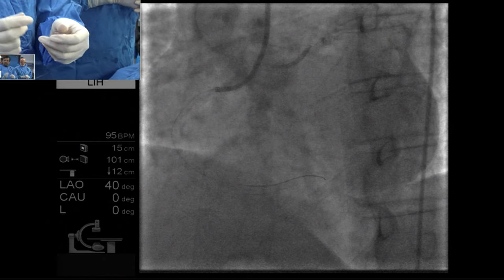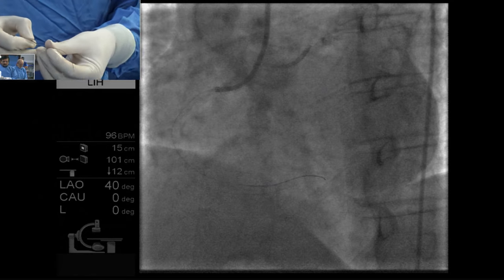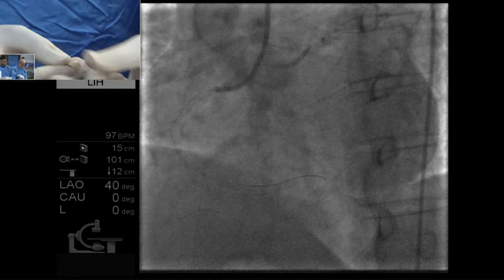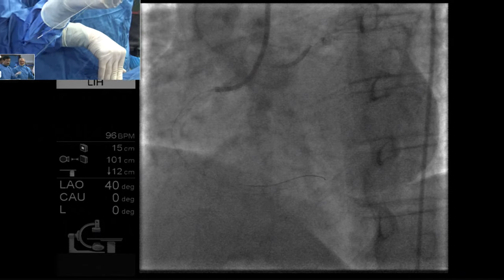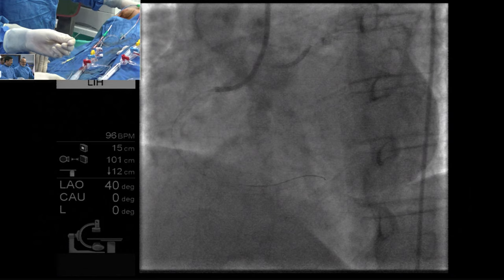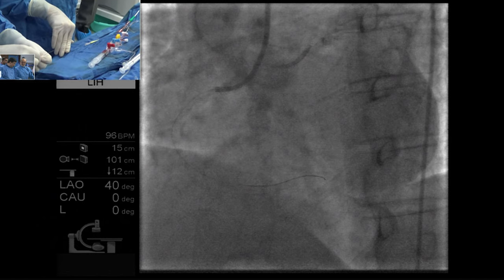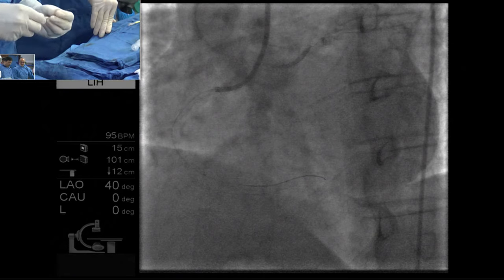Sanjay wants to do balloon trapping to remove the microcatheter. You can also blow it off with an indeflator, with solution inside the indeflator. Yeah, hydraulic technique, but that may not be reliable. Sanjay wants to make 100% sure, right? Take a new one if at all there is any problem here.